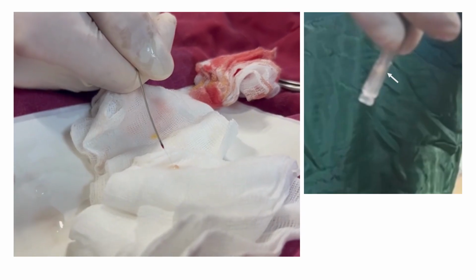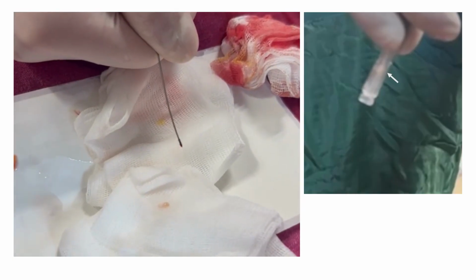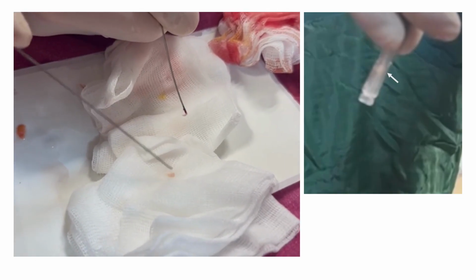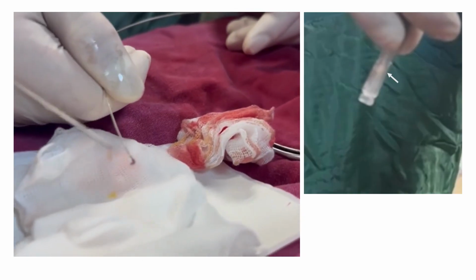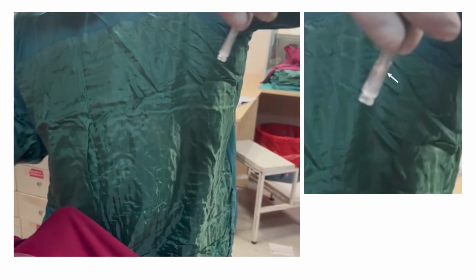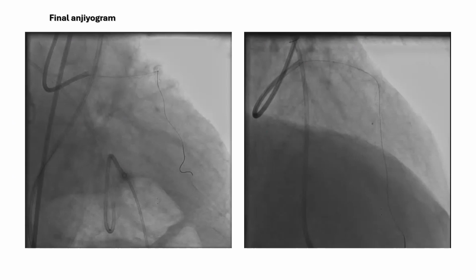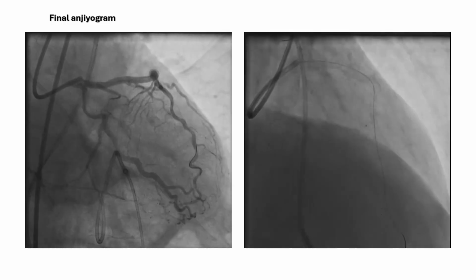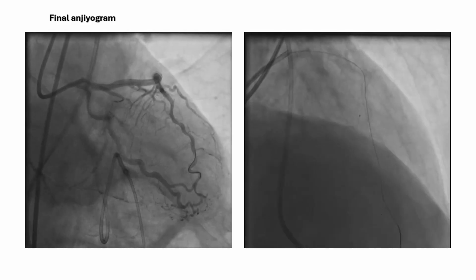The fat needed to pass through the narrow microcatheter lumen and reach the distal septal branch. To achieve this, the microcatheter was connected to the indeflator to generate a powerful thrust. The fat pushed by the indeflator was thus embolized to the ruptured area. After this procedure, the perforation flow was stopped. The procedure was terminated, to be planned later for CTO intervention.